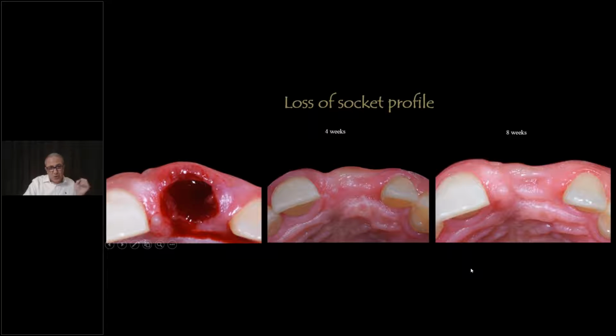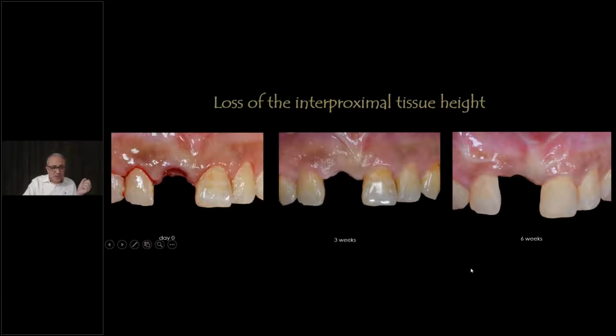That's my concern. Also, in some cases that we have done early placement for, this is day 0, this is 3 weeks, and at 6 weeks time, we lost the papillae. That's another thing. Personally, I'm not sure about others, but if I lose this papillae, I'm not sure I will be able to regain it back.